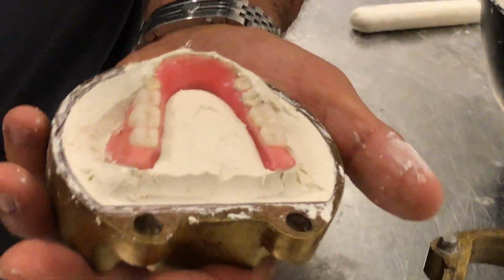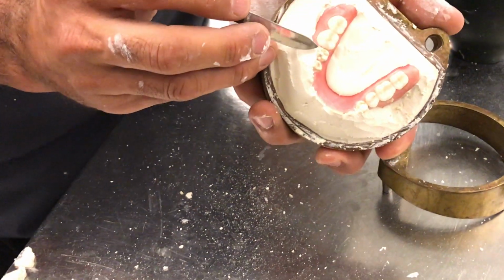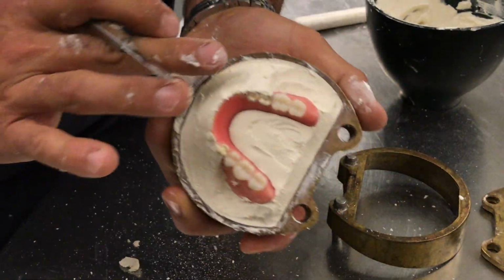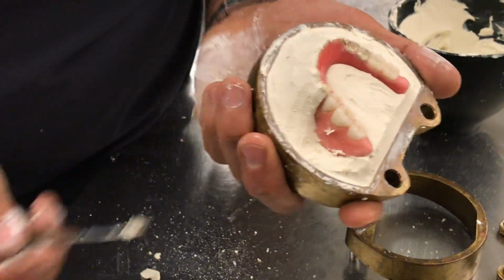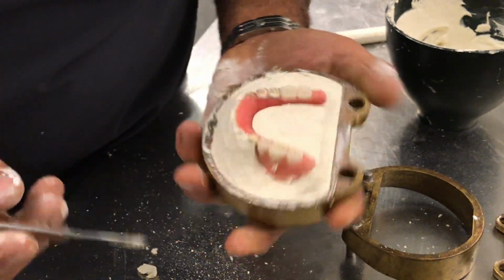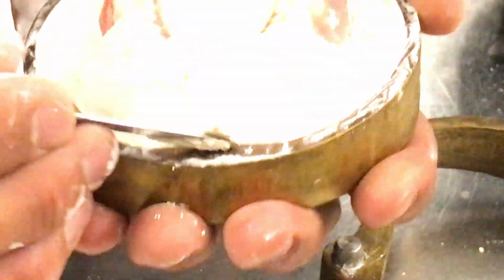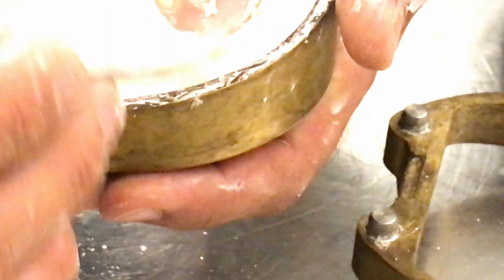Back here. Make sure you expose there's a little flat part of the ledge of the flask at the front. Make sure you expose that completely. This area here. Some flasks have it, some don't.